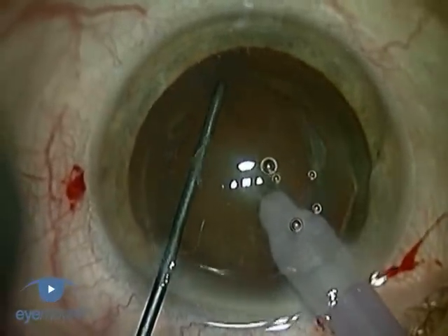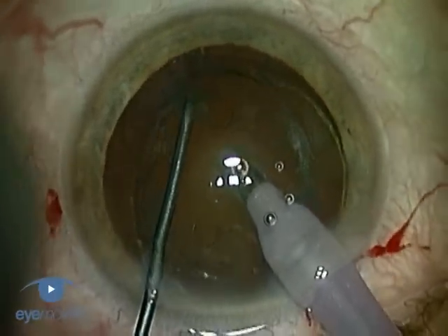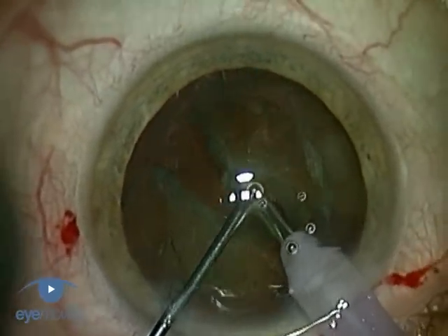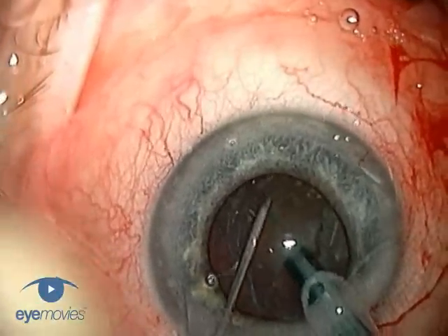Chopping techniques use an angled metal instrument to help disassemble the lens nucleus. They can be a little more difficult to master, but once learned, they help to reduce phaco time, especially with hard nuclei.